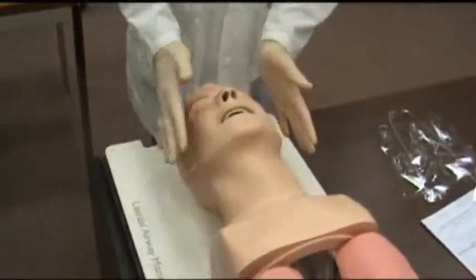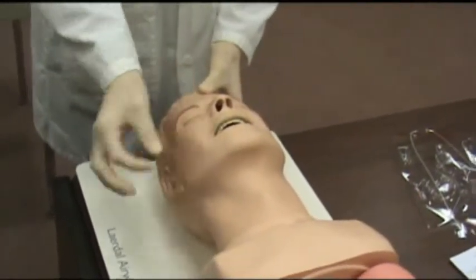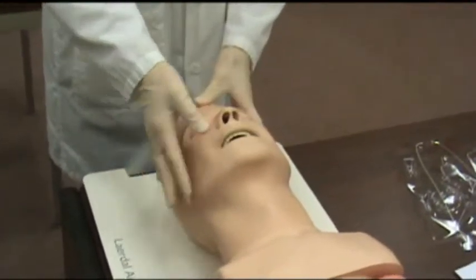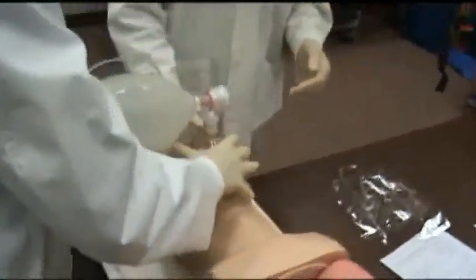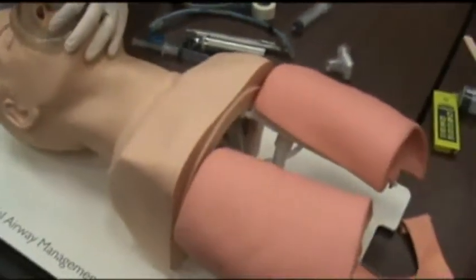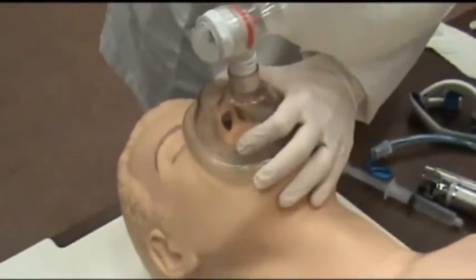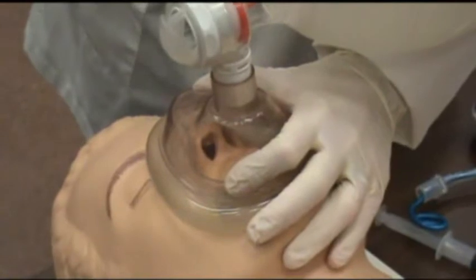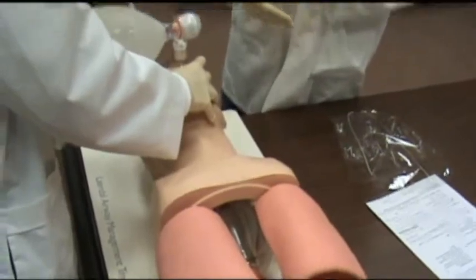This is not an all-inclusive video, so there are other methods of performing intubation. The first step is to approach the patient's head from behind and make sure they have an open airway with nothing obstructing it. If there is any fluid, you would suction out their mouth, then perform the bag valve mask procedure to give them oxygen prior to intubation — roughly once every six seconds. After about 30 seconds, the patient has been pre-oxygenated and is ready to be intubated.